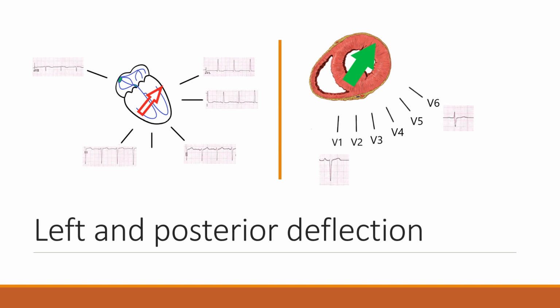And by the way, that means you have a problem with the right ventricle, and that would correlate with things like pulmonary disease. Why pulmonary disease? Because the right ventricle pumps blood to the lungs. And so people with pulmonary disease will end up developing right ventricular hypertrophy as a result. If they have chronic end-stage COPD, perhaps, that's a very common thing that can occur because they have high pulmonary pressures, and over time the right ventricle becomes hypertrophic, it produces more energy, and bam, you end up with a right axis. Do you have to have that on every one? Absolutely not, but it can happen.